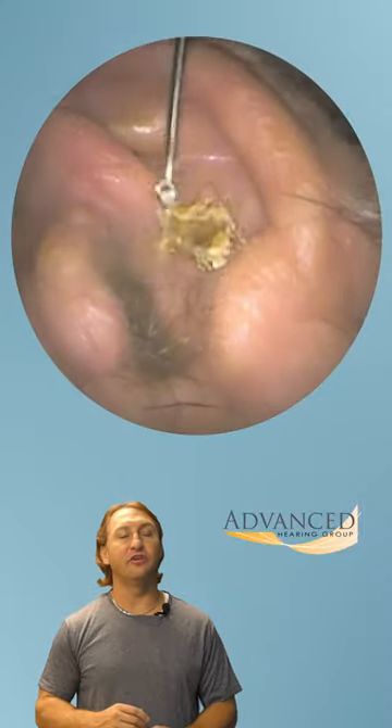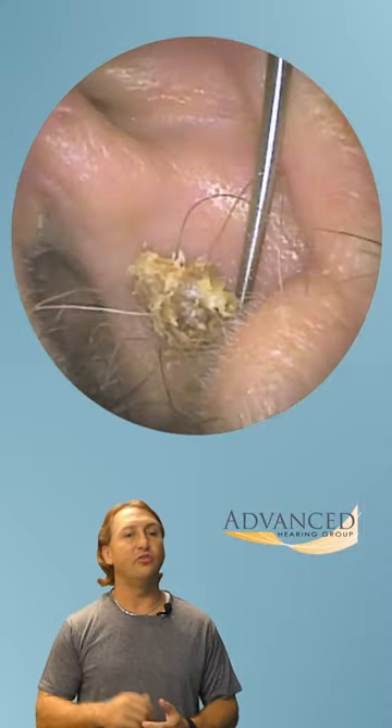I'm Dr. Gary, a clinical audiologist with Advanced Hearing Group. Enjoy the wax removal.